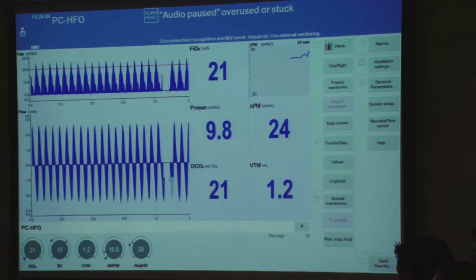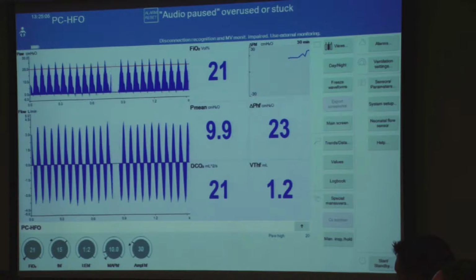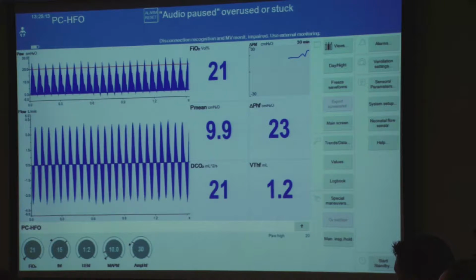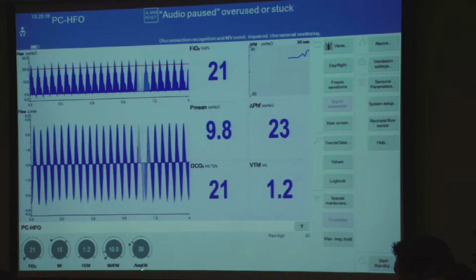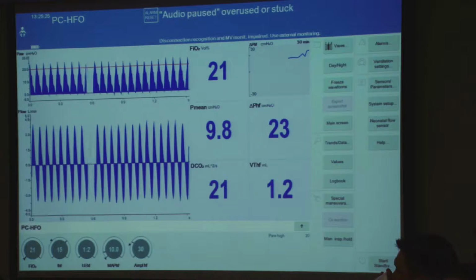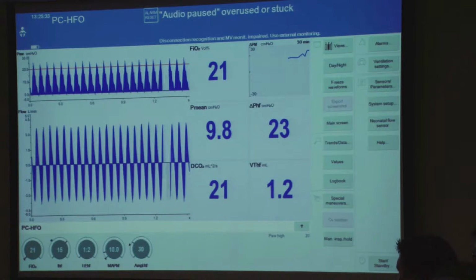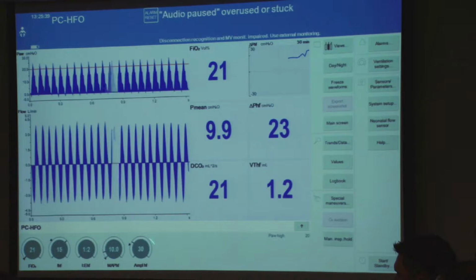Nothing whatsoever. So this is what happened to our new doctor in the unit. She was at a very reasonable amplitude, but she was not getting any results. Why? Because although she was dialing this here, nothing was happening there. And this is interesting, because that's why it's so important to have the true amplitude on the screen. Otherwise, you won't know that this is happening, and you'll feel very comfortable with what's going on here.